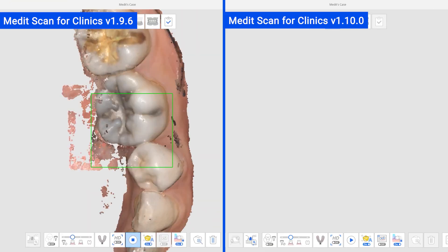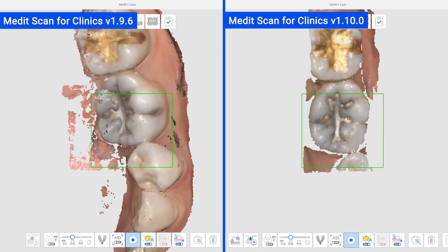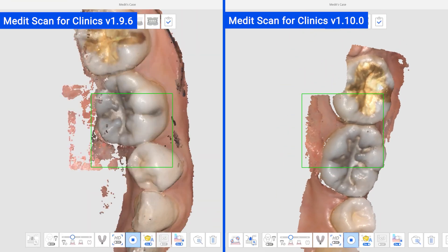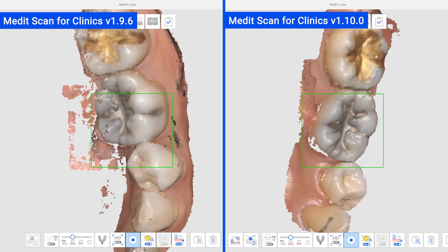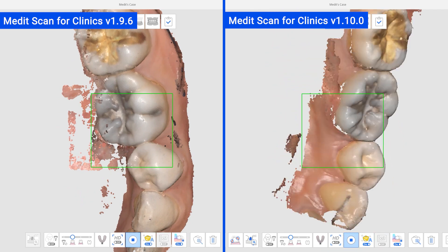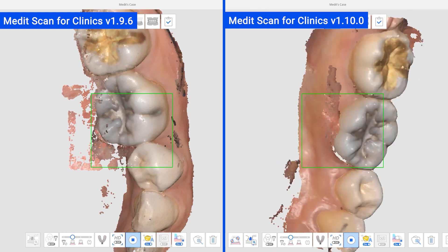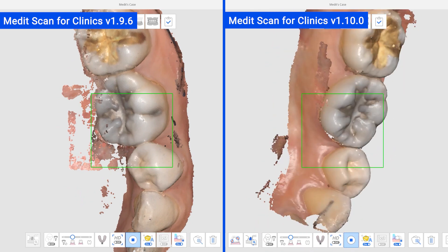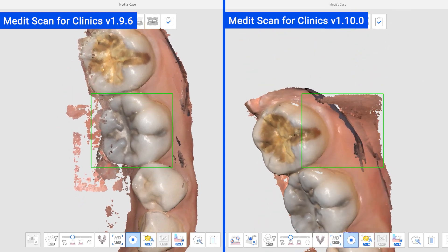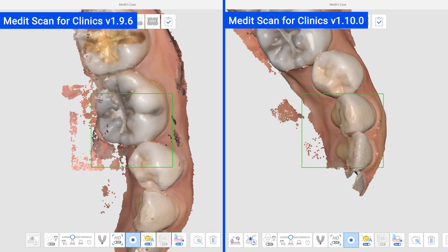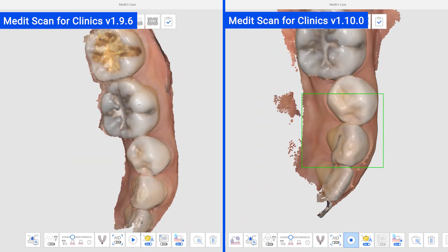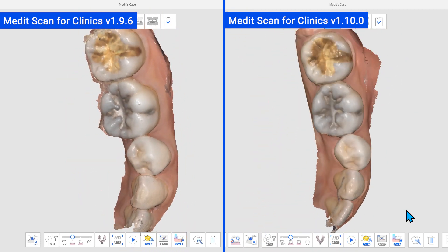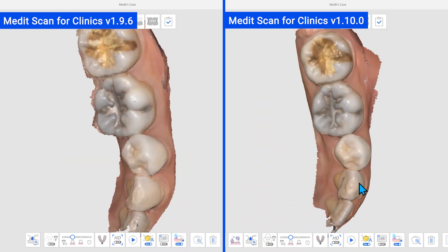In addition, the optimization of the processing speed allows you to experience fast scanning even on low-spec PCs or Macs. You can experience comfortable scanning with a variety of graphics cards, from NVIDIA GeForce's GTX 10 series to the latest RTX 40 series.